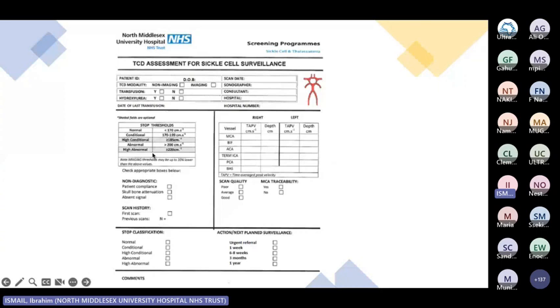And I haven't really discussed this much, but if it's high abnormal, anything above 220 centimeters per second, that's an urgent referral. That needs to be addressed on the day by a consultant hematologist or pediatric consultant, who need to address it immediately and look at a tailored plan for that patient in time.